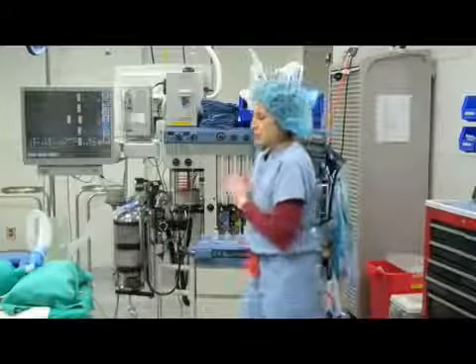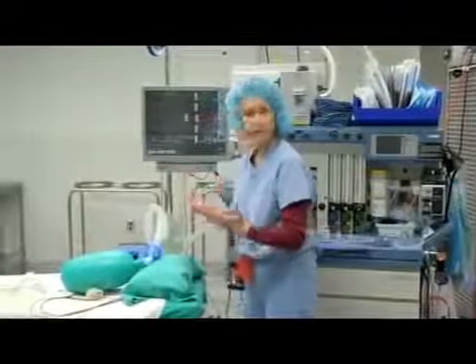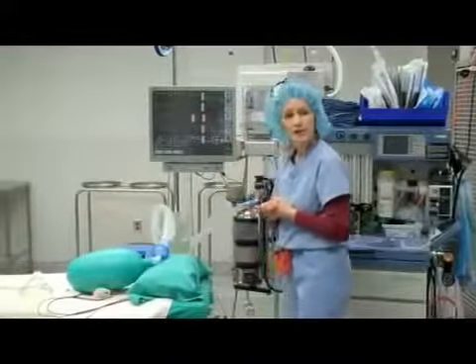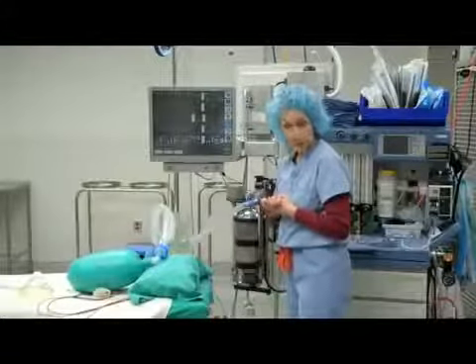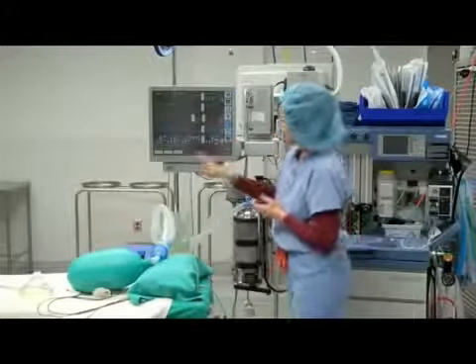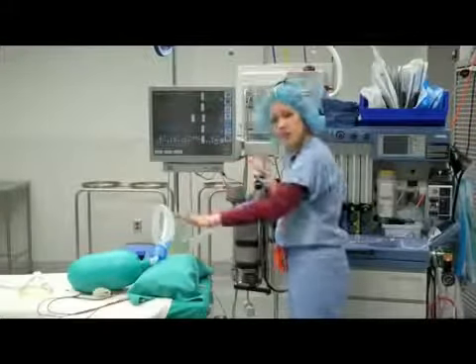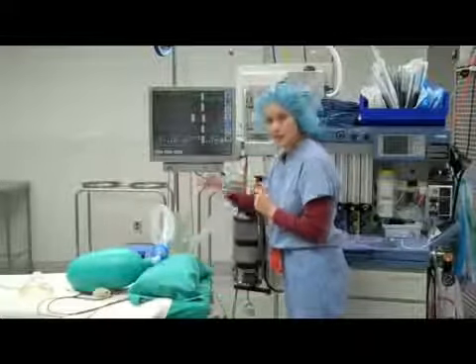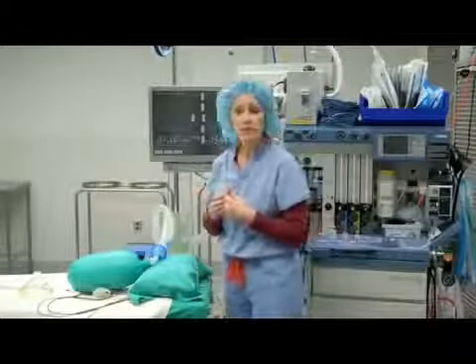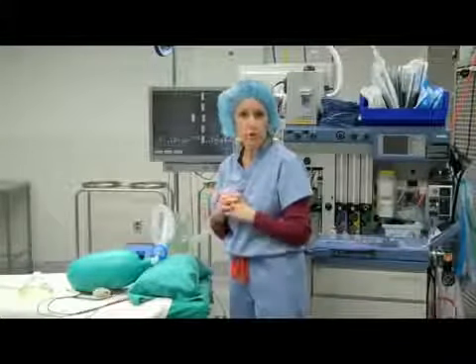So during surgery, we are able to maintain the patient's status. We are constantly looking at the heart rate and the heart rhythm. We're looking at blood pressure monitoring, and we're also able to look at the percentage of anesthesia gas being delivered to the patient and the anesthetic gas that's coming from the patient. We also can deliver additional pain medications and additional medications to relax the muscles for surgery.